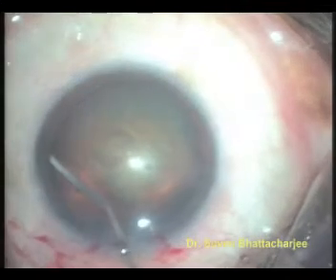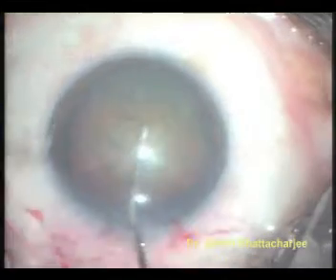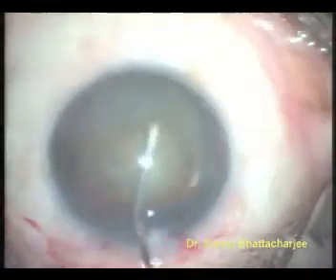Balanced salt solution is injected under the anterior capsule to separate the flesh of the cataract, or the cortex, from the peel of the cataract, or the capsule.